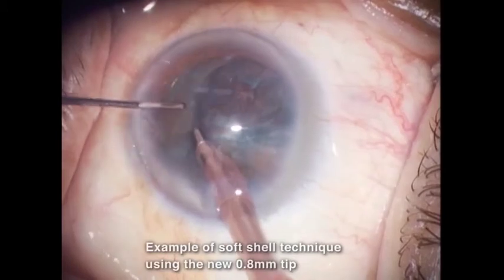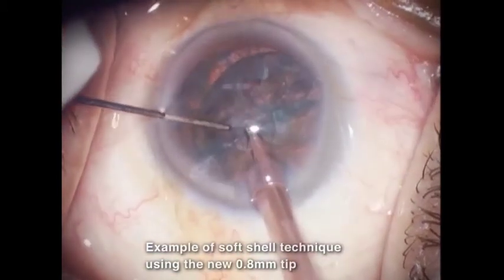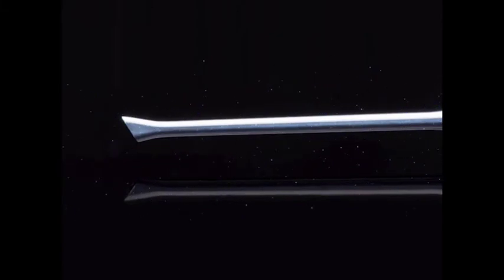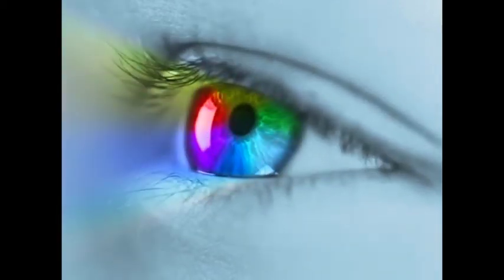Along with protection offered by the Viscoat soft shell technique, this new tip promises to greatly reduce the threat of hydroxyl radicals generated by PEA cavitation. It will be ready for practical application soon.